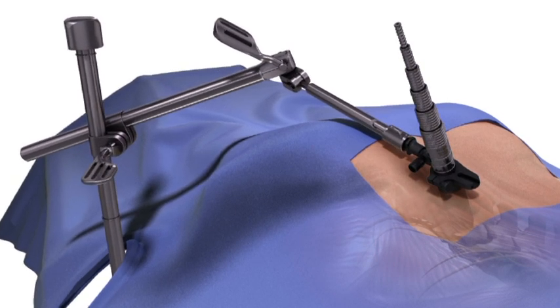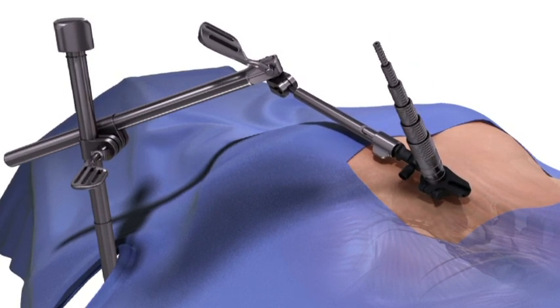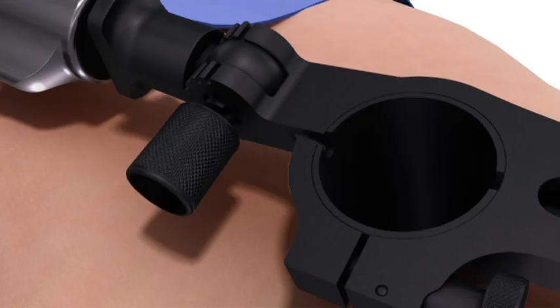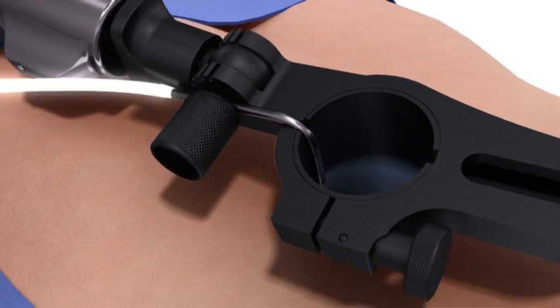Adjust the post to be parallel to the patient's skin and connect the support arm to the post. Make final trajectory adjustments, lock it into place, and remove the dilators. If supplemental light is desired, an LED fiber optic cable can be attached to the retractor.